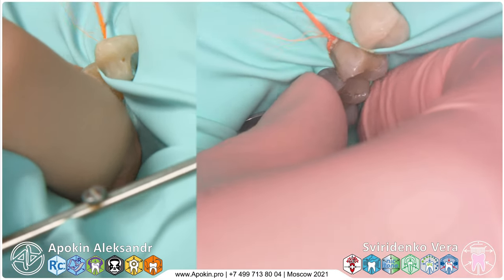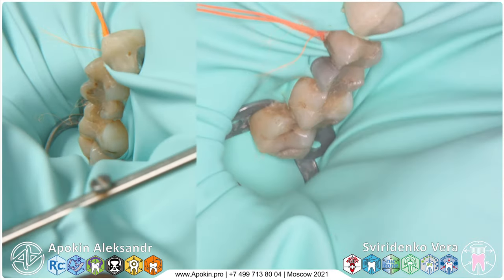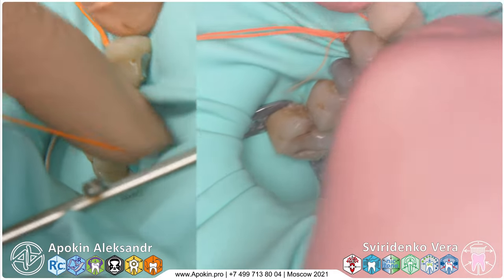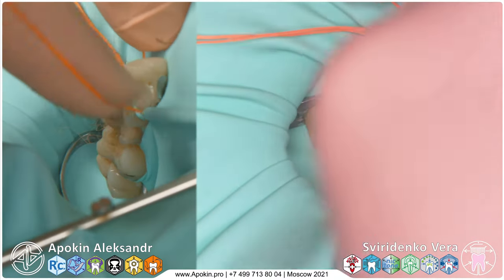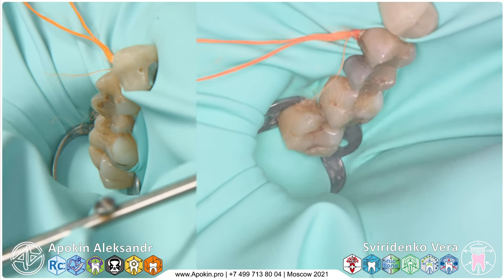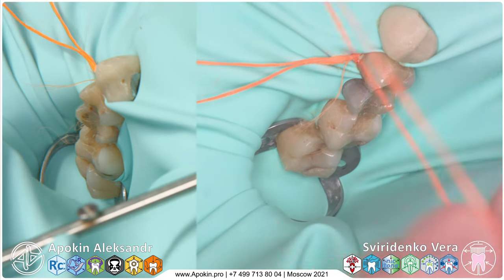Insert ligature, good, and check again the interdental space near the crown. This is good. Then again the next ligature for tooth 15. We made it again.